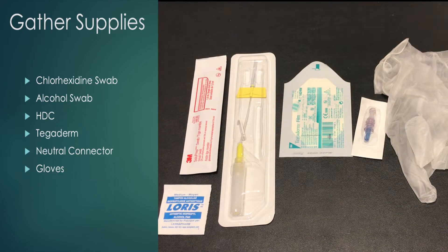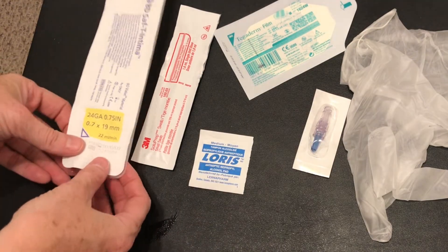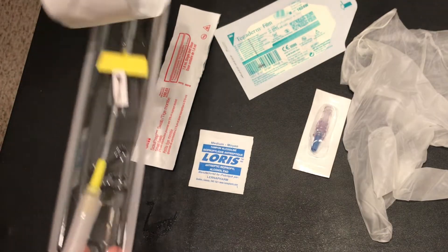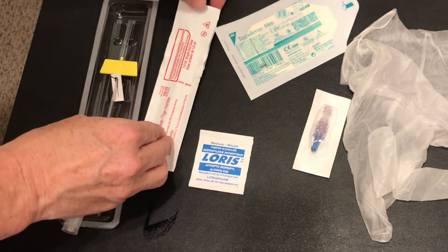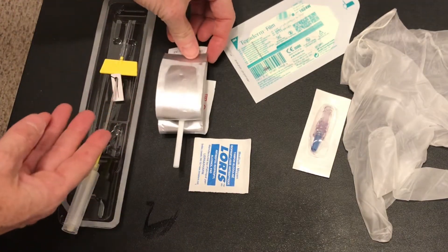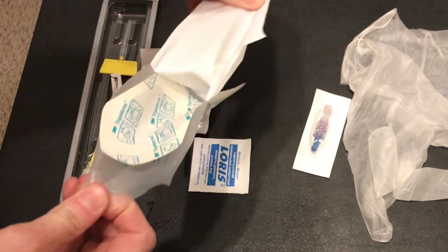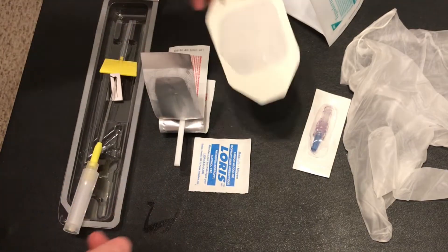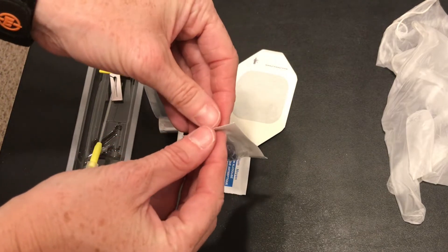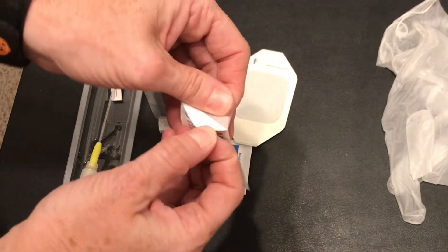After we've washed our hands we would start the procedure. What we want to do now is prepare our equipment. We're going to open up our package — first thing is to check the expiry date — and then we can open this up. I'm going to get my swab ready, take out my securing device, and open up my neutral connector.